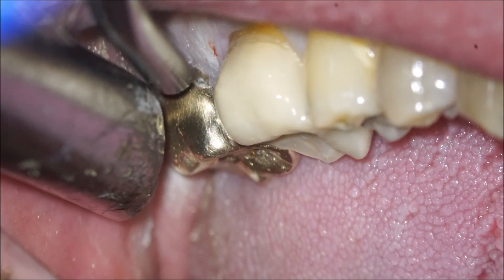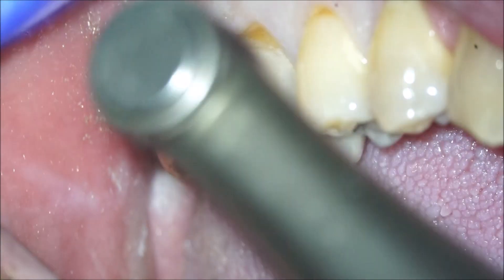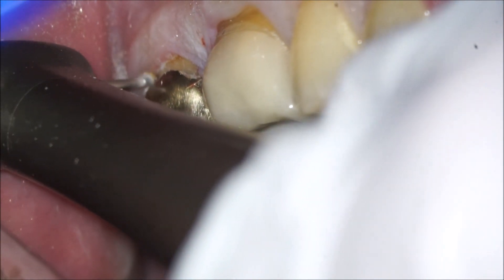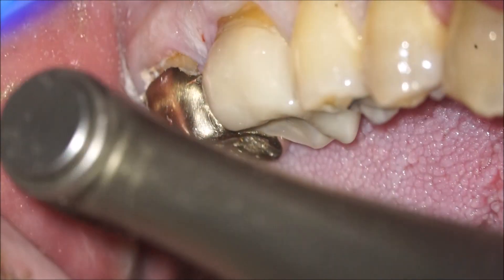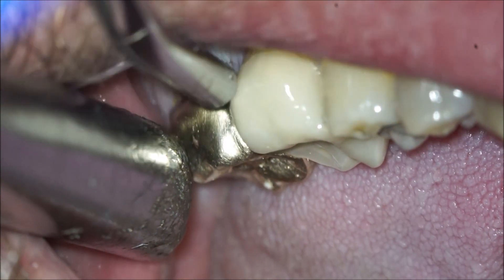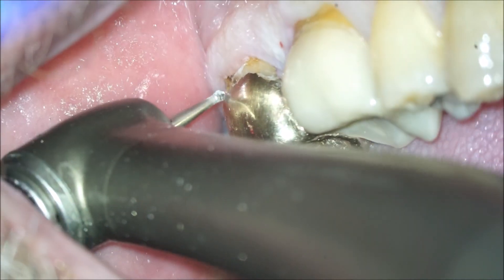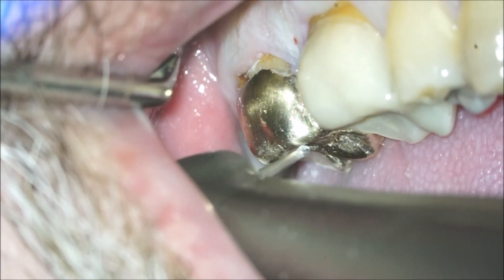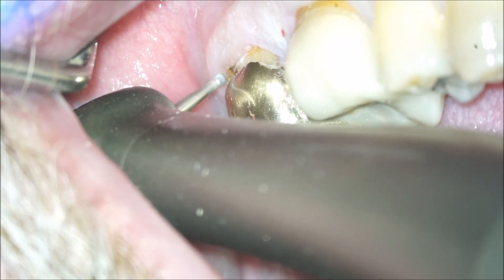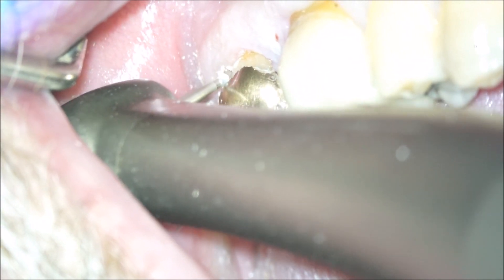You'll notice I'm doing a really light touch, just really quick in-and-out movements. We're taking away a little bit of the crown where the decay is extending up underneath it. Being full gold, that preps away very easily. As long as you're using that really light motion and not trying to do too much at once, it works very well to do these dry. I wouldn't want to do a full crown prep or a typical class two preparation this way, but something like this it works well.